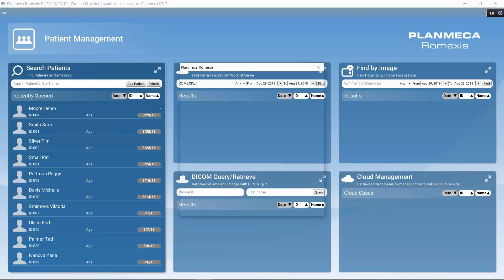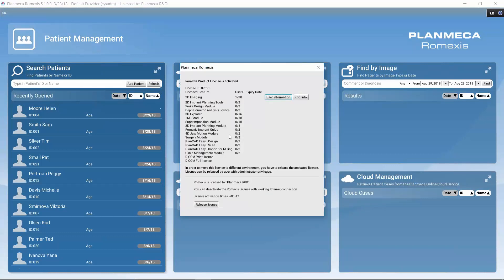Opening the license management shows a list of all the functions included in our license and how many users are currently using each function. Through user information we can see which clients are using specific functions and drop those clients so licenses are released for other users. In this standalone installation, server and client are on the same computer, so we can release a license to be used on another computer.